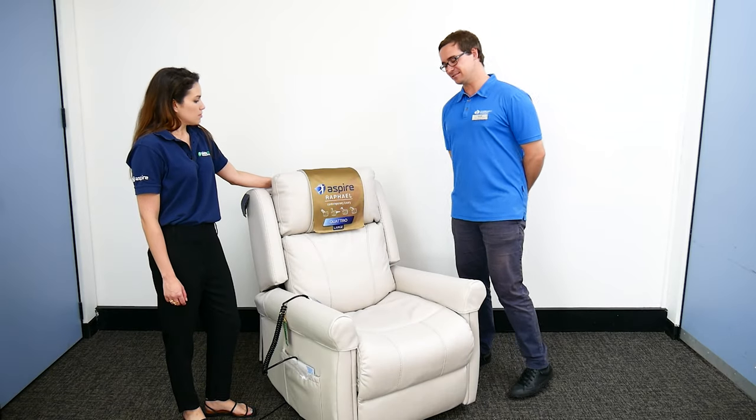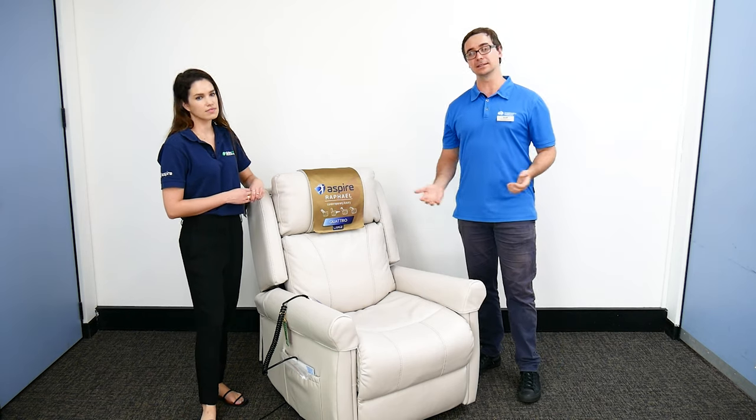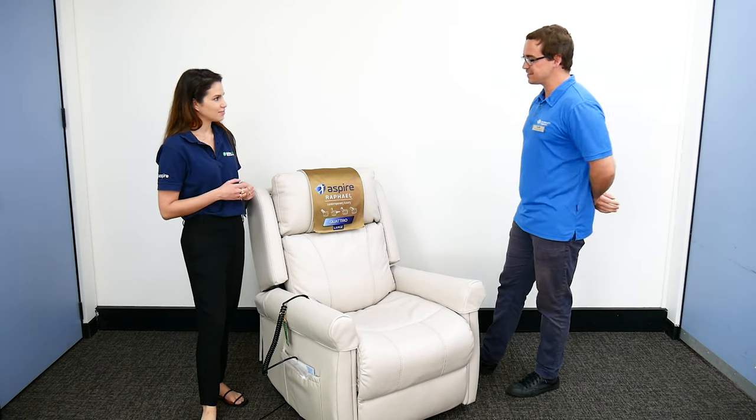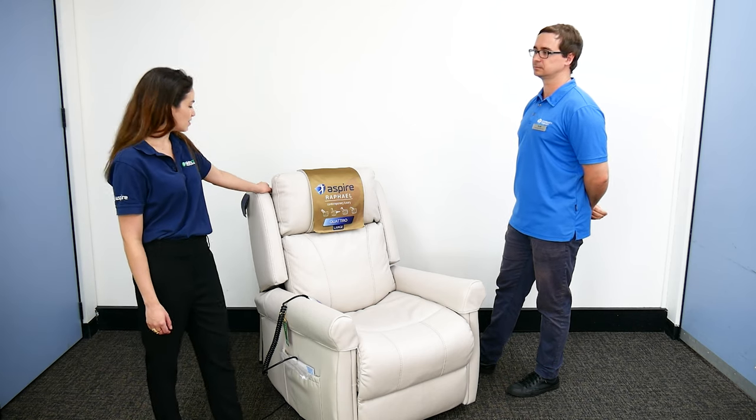We're at AdaCare in Cardiff today, looking at a recliner — but we'll also be talking about recliners in general. I've got Ali with me today. What model do we have here? This is our Raphael Quattro recliner chair.